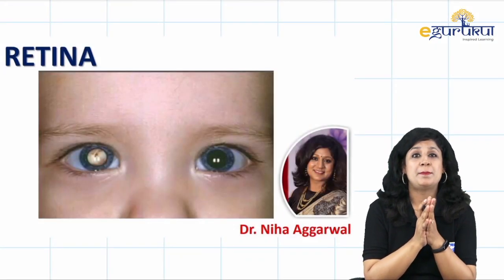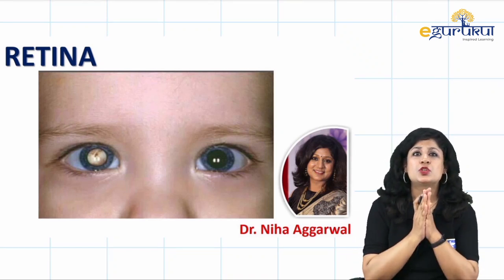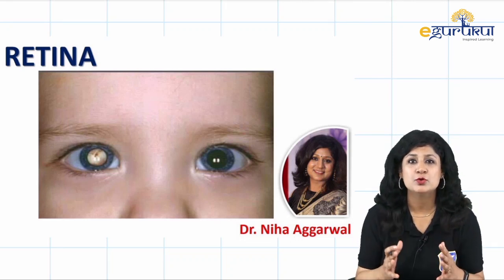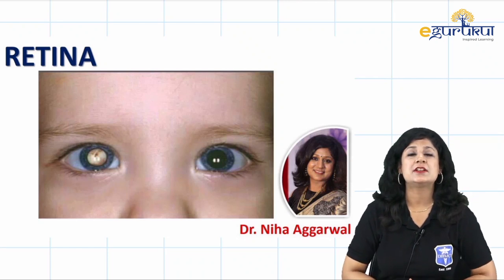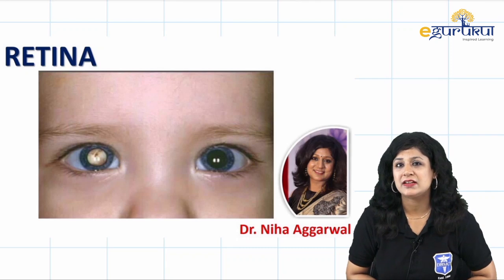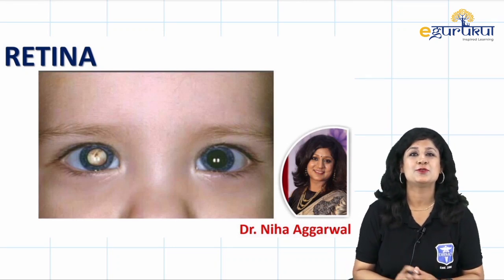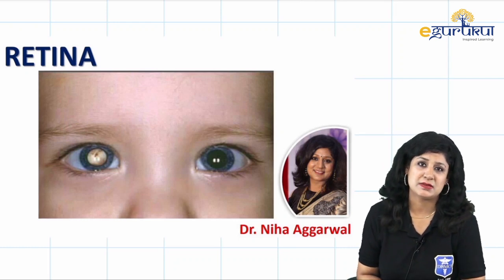As your paper is very near, your FMG exam is very near. So we are here to discuss some of the important images that will brush up your preparation and boost you like anything in your final exam. I always get so many messages regarding the discussion of fundus images and retina images, because they are often asked, very important, very high yielding, and often there is some confusion regarding the fundus images. So let us begin with the fundus images today.